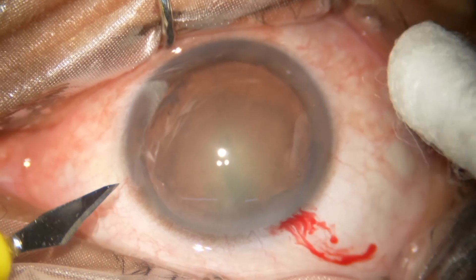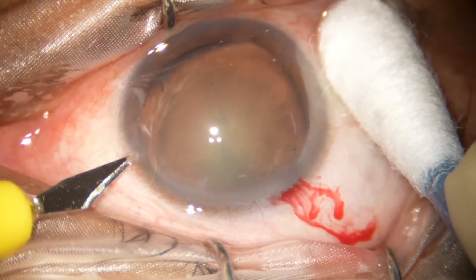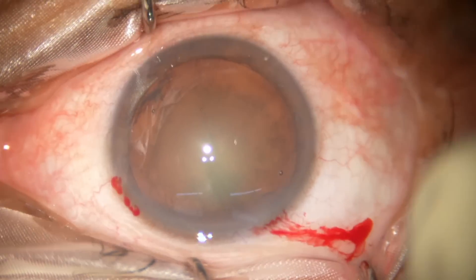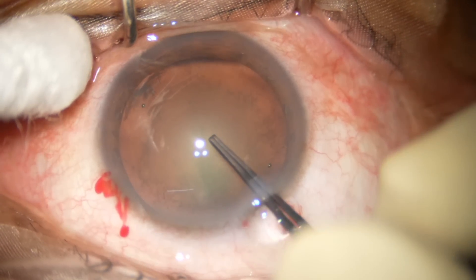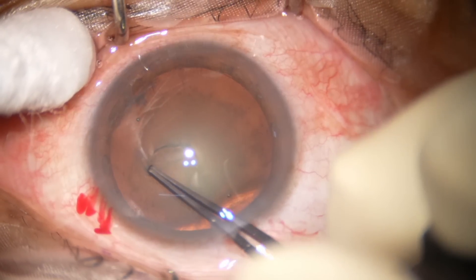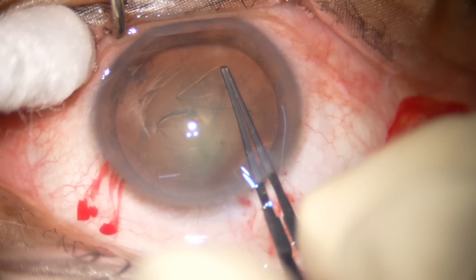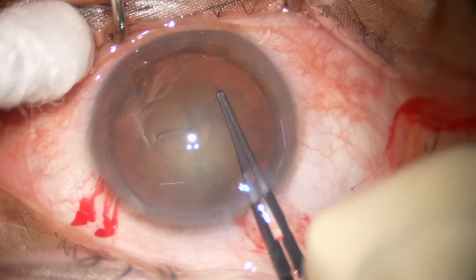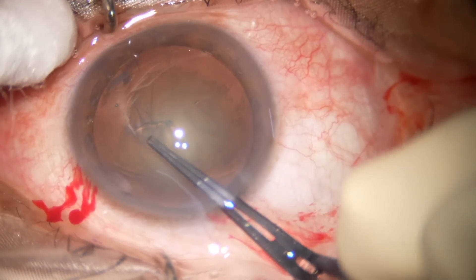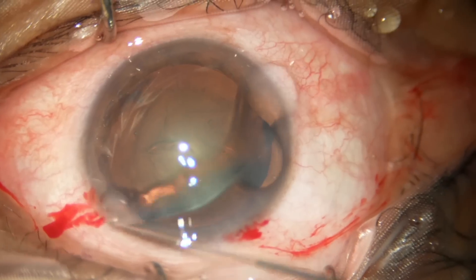The side port should be made about 90 degrees away from the main incision, so we select this side here. Now for the capsulorrhexis — I raise a capsular tag, hold this capsular tag and go anti-clockwise. You can do clockwise if you feel comfortable. Then you have to hold the other side of the cleft. And now hydrodissection.